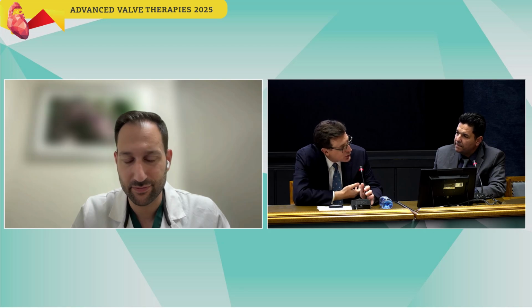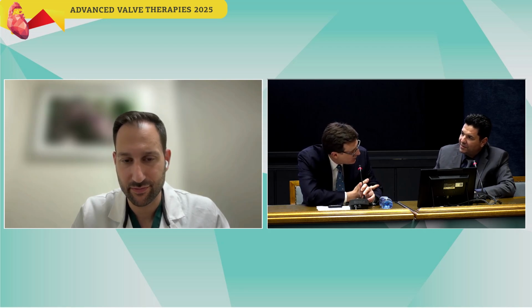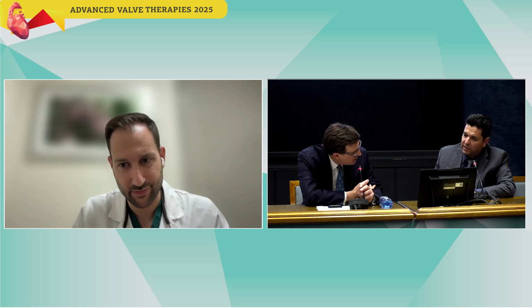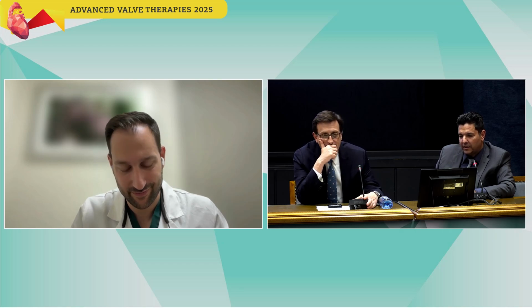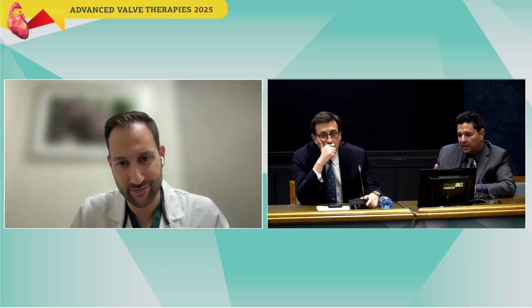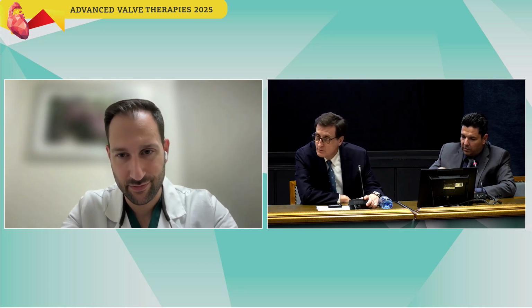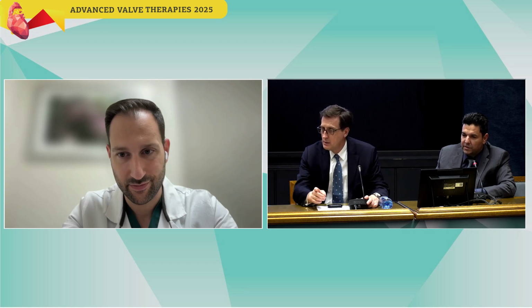What's your experience with the cost of this 3D printing? I'm amazed at how much it really costs sometimes. It's very, very cheap now. Finally. They put in the software, and within 10 minutes you get a silicone copy. And we have some valves that we try to put in, to see which one is obstructing and which is not. But what you're doing is much more sophisticated.